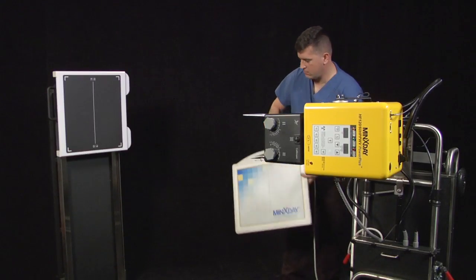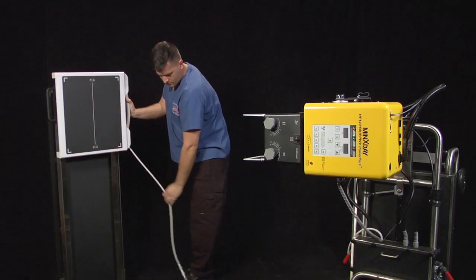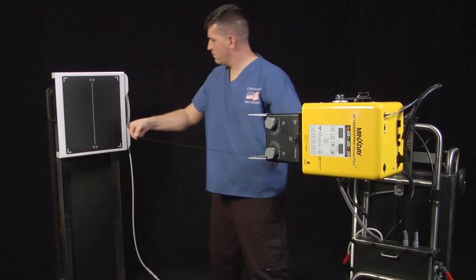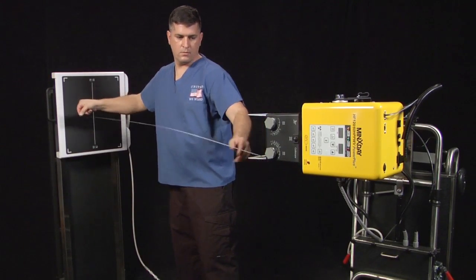Insert the Varian IP panel into the upright cassette holder. Using the tape measure located on the bottom of the collimator, pre-position the X-Ray unit 72 inches away from the upright cassette holder.